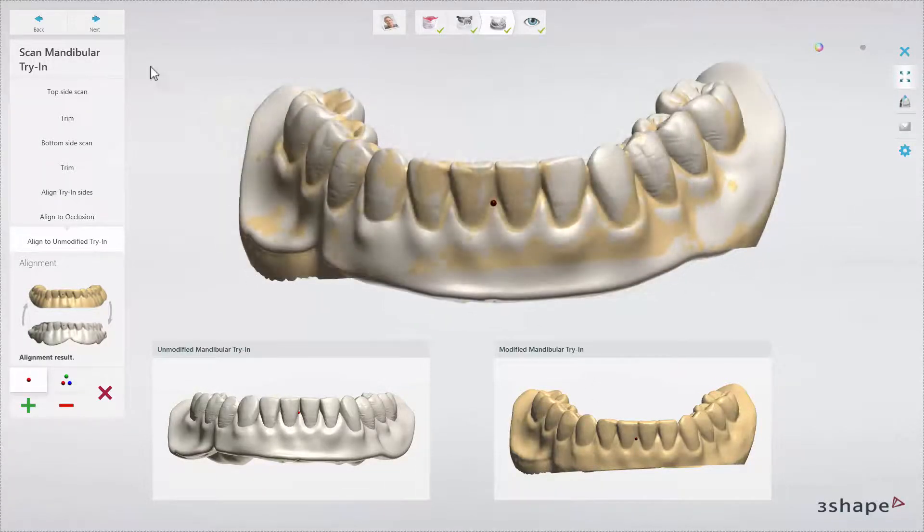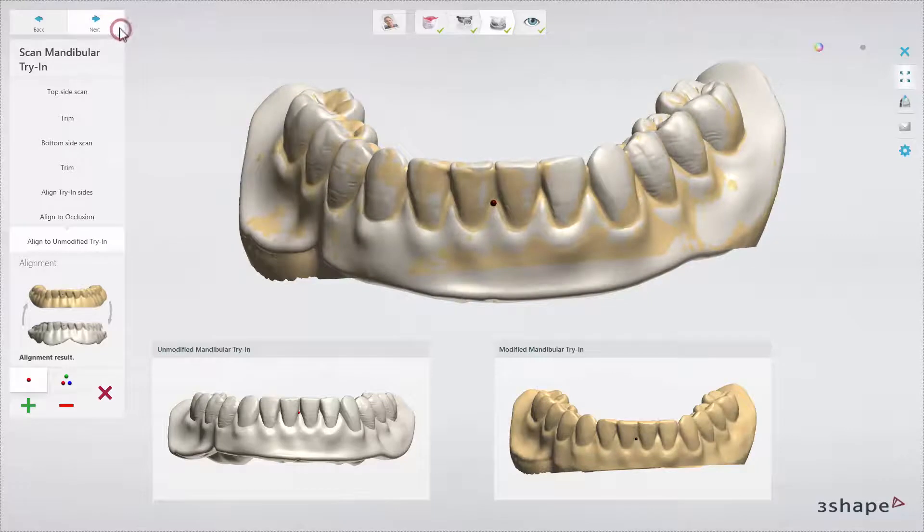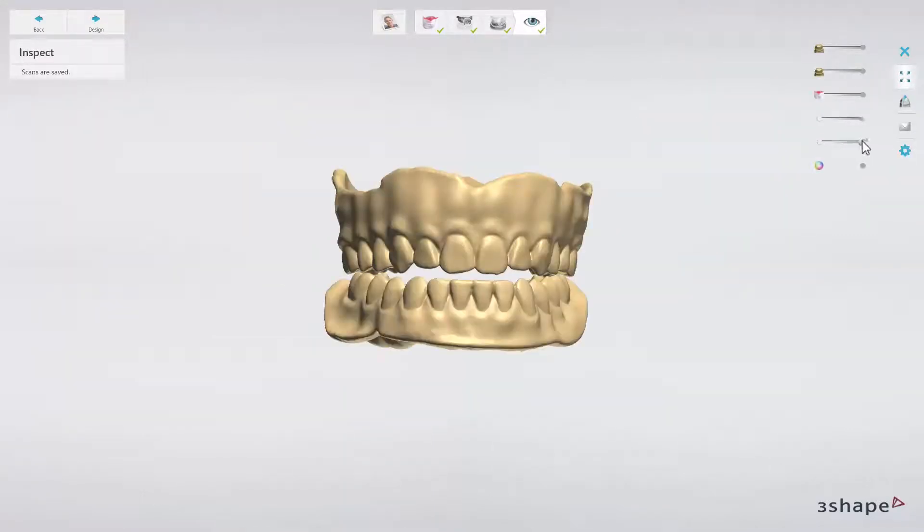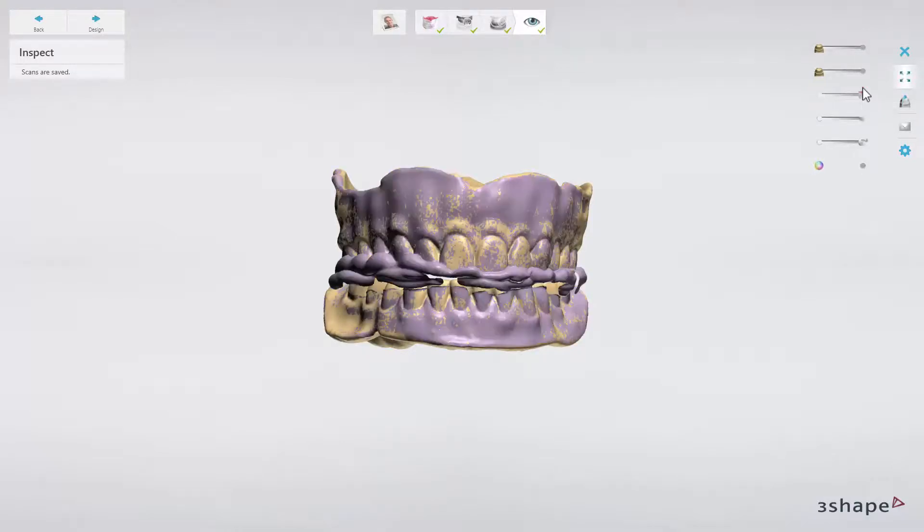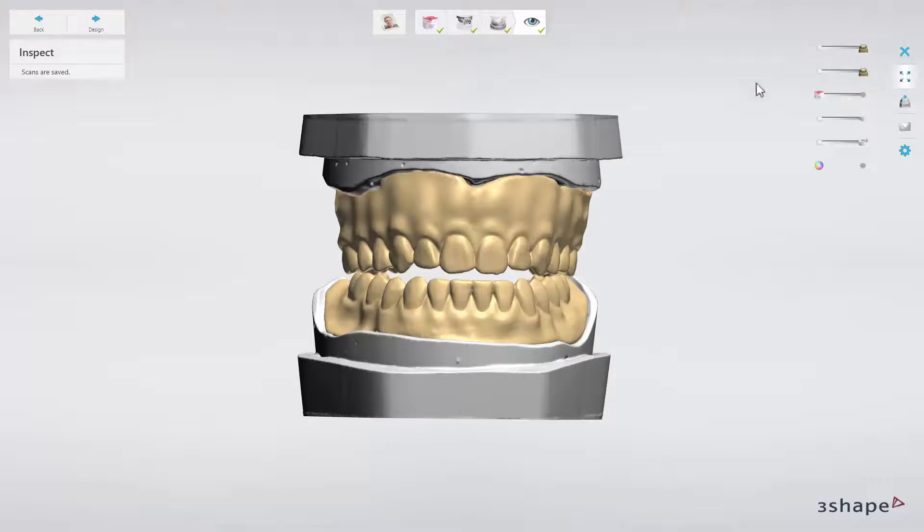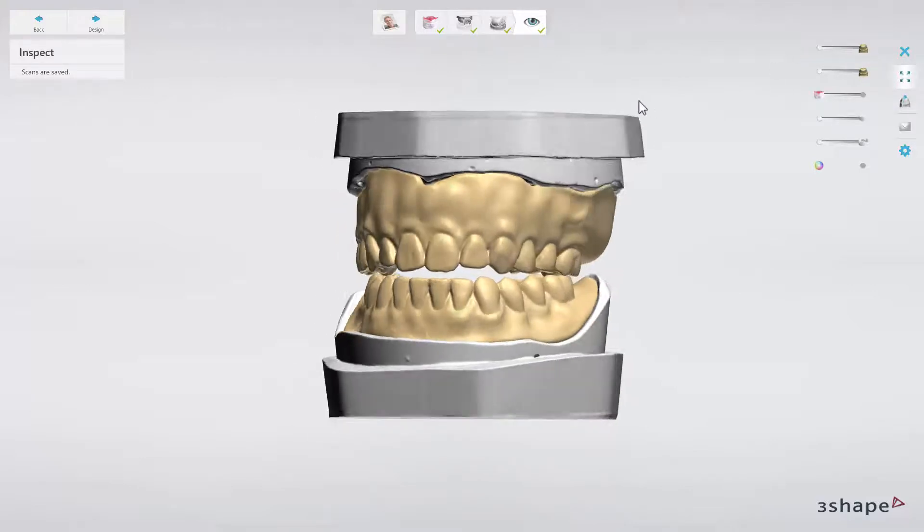When finished, click next and inspect the output for Dental Designer. You should have scans of upper and lower modified try-ins, vestibular scan, and original preparation scans in a new occlusion.